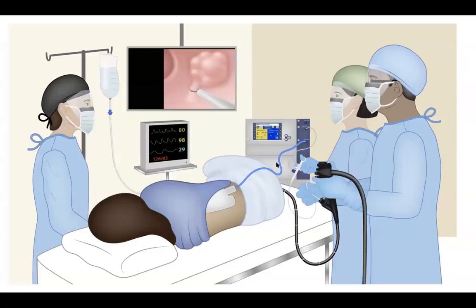All right, Raju, can I comment on that? Yeah, please. The current Olympus generator has the pulse cut mode, which is the equivalent of endocut. So you can use pulse cut fast or pulse cut slow. Ideally, pulse cut slow will be the ideal one. If I remember right, I used to use it in Nottingham, so it's nearly a year since I used it, about 20 or 30 watts. Pulse cut slow will be ideal for this sort of situation. That's the equivalent to endocut in Olympus. That's the latest generator. Oh, that's good.